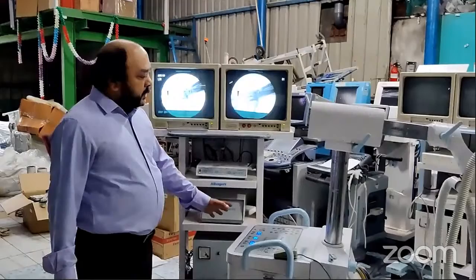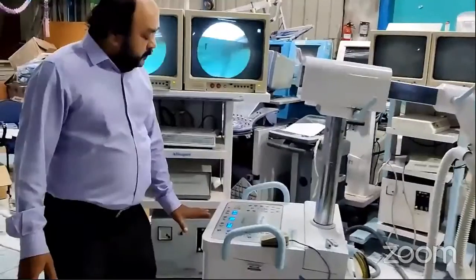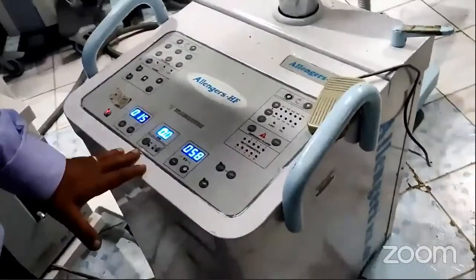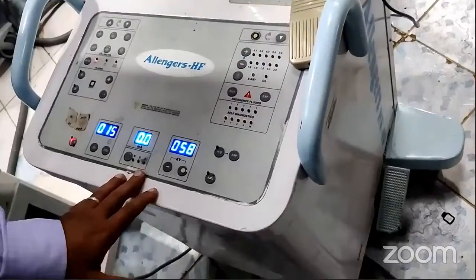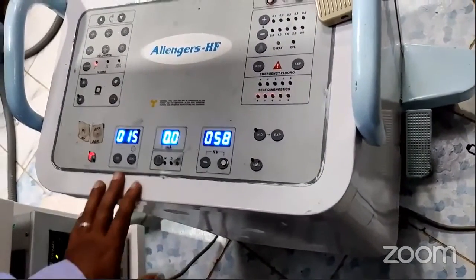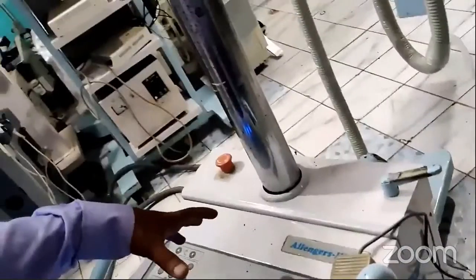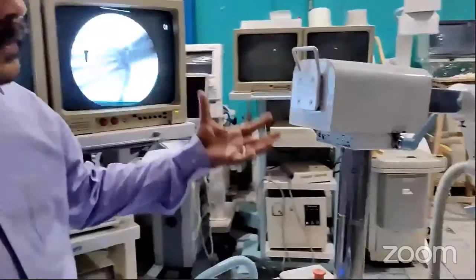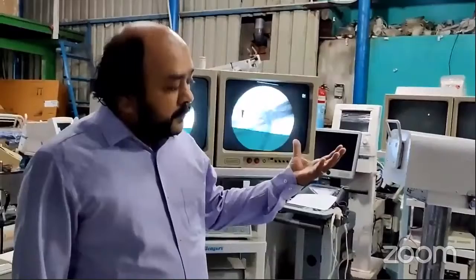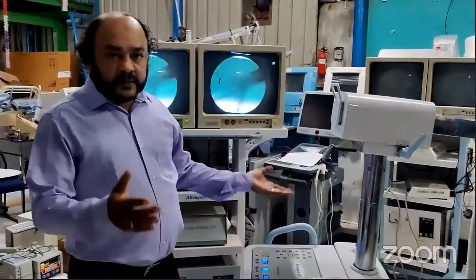And this can be operated through the console. In that console you can see the kV and mA, how much kV you need and how much mA you need. Inside the machine there is a motor, so the motor will move the C up and down, and you can also rotate 180 degrees.